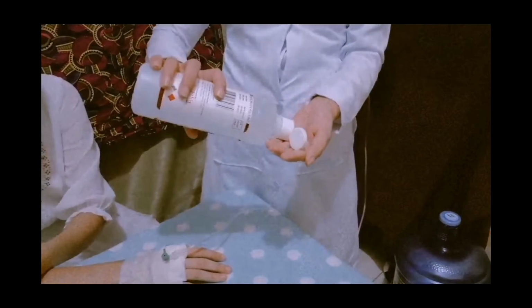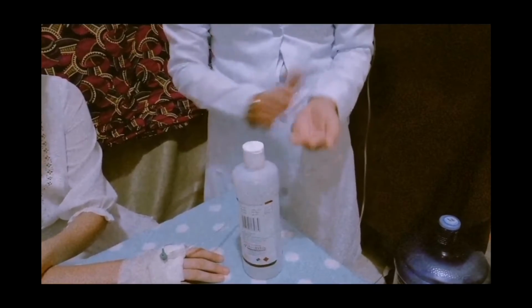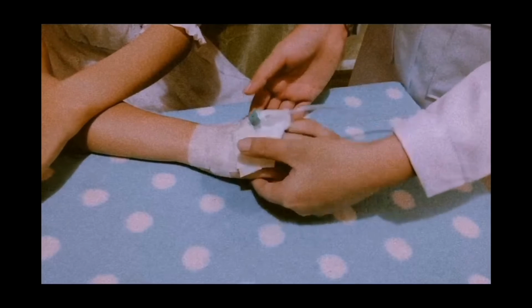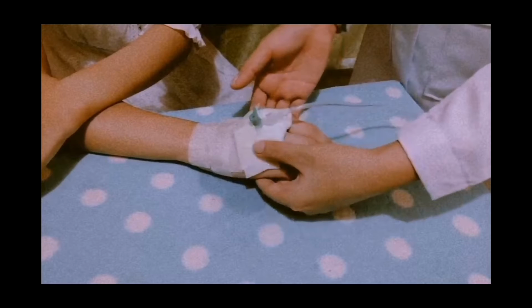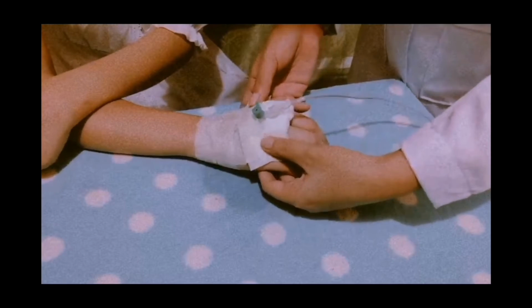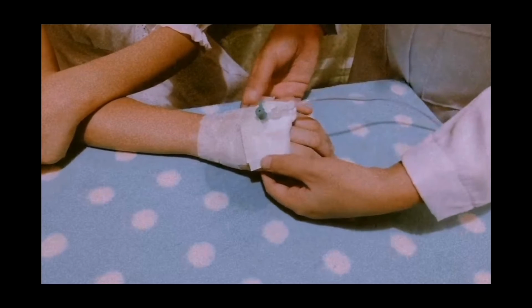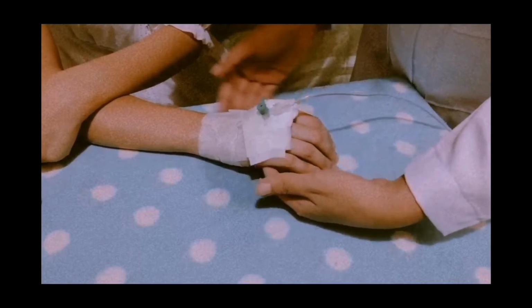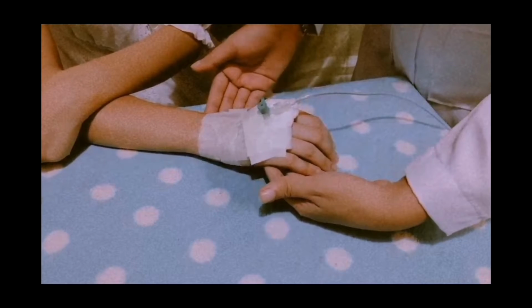Third is to perform hand hygiene. Inspect IV site for signs and symptoms of IV-related complications such as pain, swelling, or redness. Observation or reports of any IV-related complications indicate need to re-establish patent IV access.